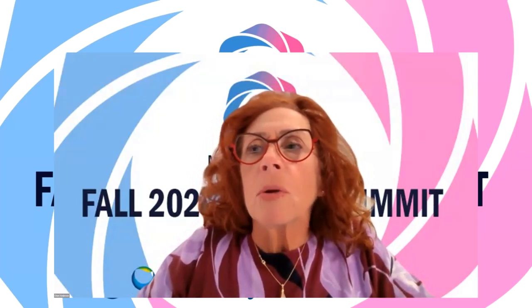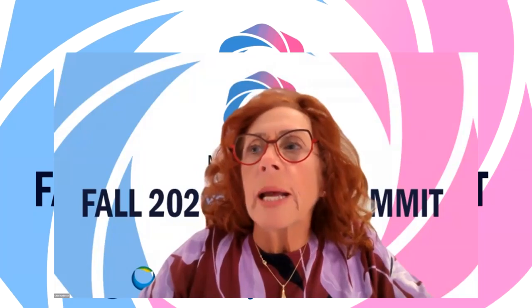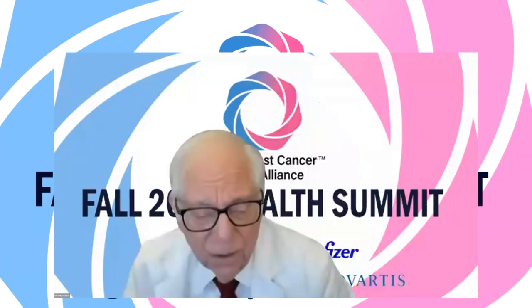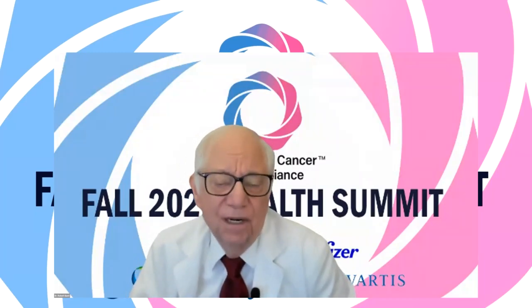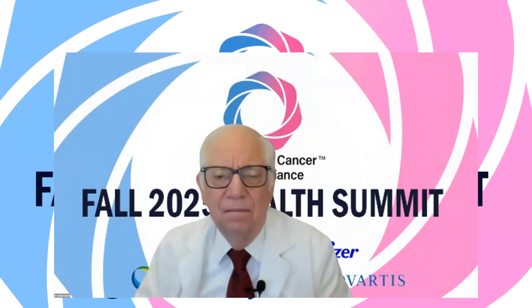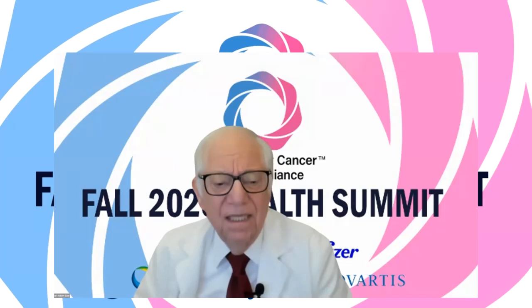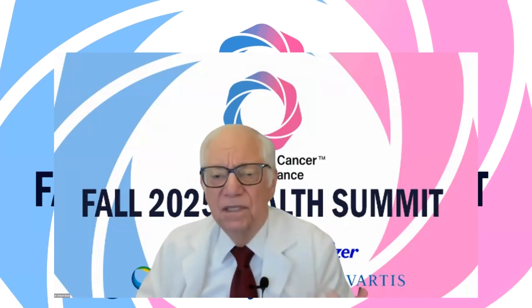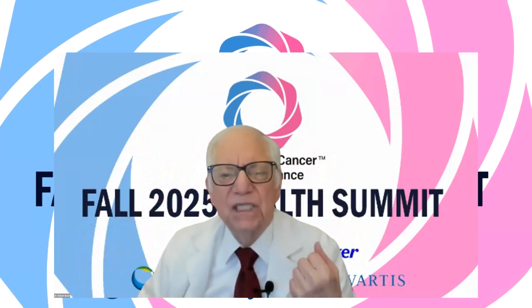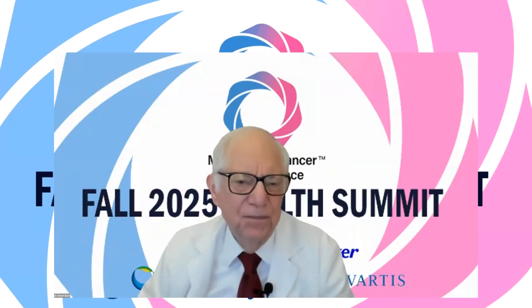How can cancer be missed by mammograms or MRIs? And why does ultrasound sometimes find what other studies missed? Thank you for that question, because this is how I got started. 40 years ago, I was working with the top mammography cancer surgeon in New York, and he was tearing his hair out because you could feel the lump, but the mammogram would not show it. So in dense breast tissue, the ultrasound sees it very, very well.